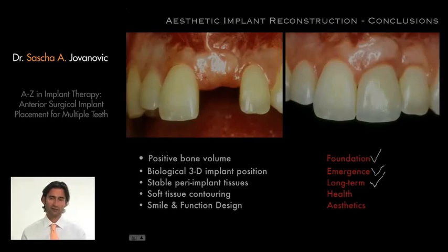So soft tissue grafting is more needed for multiple teeth than for single teeth, because we want to thicken that soft tissue. Now, soft tissue contouring is also more problematic with multiple teeth, because you need to be very careful in managing the papillae between the 2 implants, also with a pontic. So you have to have some experience with contouring pontics for emergence profile.